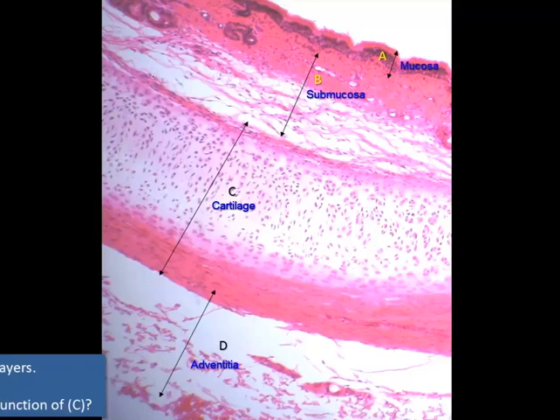So this respiratory passage is not a bronchus, although the full extent of C is not shown, the cartilage is in fact in the form of a C-shaped cartilage rather than in the form of small cartilage plates. Small cartilage plates are expected to be present in the bronchus. So this cartilage is a continuous large C-shaped cartilage, a feature of the trachea. There are about 16 to 20 of these C-shaped hyaline cartilages. Some anastomose with adjacent cartilages.